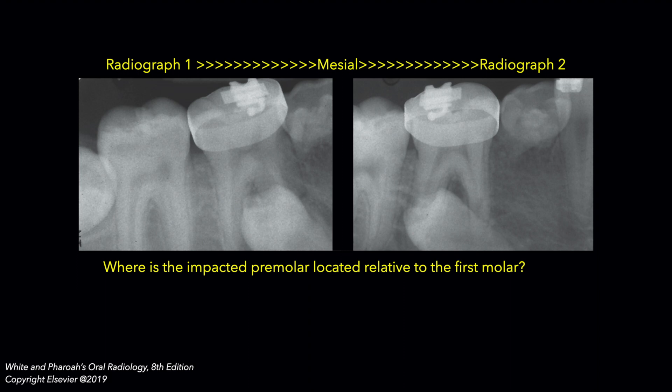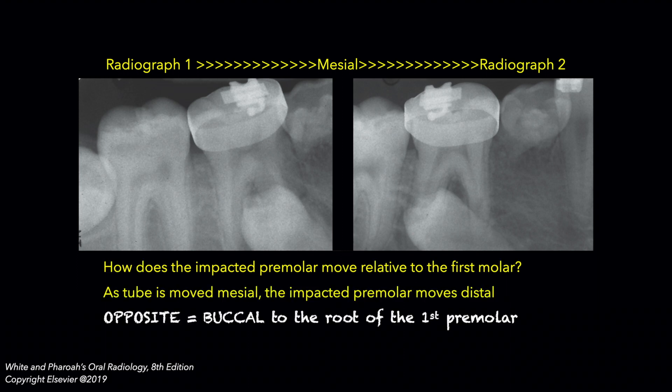Now let's go back to our original problem of localizing an impacted tooth and apply the tube shift technique. In these two periapical radiographs, we see an impacted second premolar that is superimposed over the mesial root and furcation of the mandibular first molar. Note that with the mesial tube movement, the image of the premolar appears to move distally relative to the mandibular molar roots, indicating that it is positioned buccal to these roots. As confirmation, note that the orthodontic bracket affixed on the buccal surface also moves distally with the mesial tube movement.